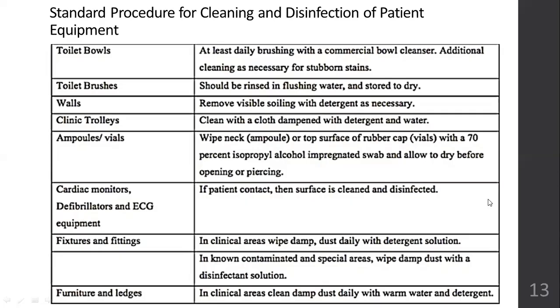Cardiac monitors and defibrillators, ECG equipment, if you have used it on a patient, then the surface that touches the patient should be cleaned and disinfected before you use it on another patient. Usually the ECG equipment and all.